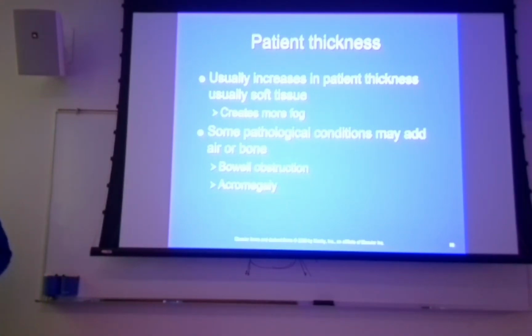NG tube. Yeah. If they have an NG tube in, and that NG tube is hooked up to suction, and there's bile in the canister, nine times out of ten that patient has a bowel obstruction. Well, okay, you think of bowel obstruction, you keep putting stuff in and it's not coming out, then it's all solid matter inside of the patient, right? So you need to increase your technique.